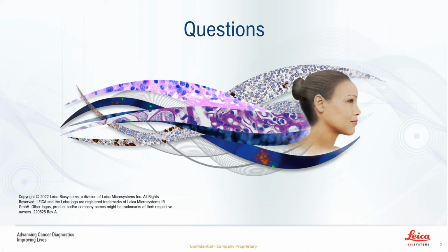I think the first is if it's specifically on the color of the glass. Sometimes these can have a slightly green tint or other very slight color tints to the glass. If you're looking to standardize on that part, I think it'd be interesting to look at some of the functionality within different scanners that will white balance. So detect a piece on the slide where there is no tissue or no sample, and look to white balance on that. So effectively normalize on your color profile in that way.